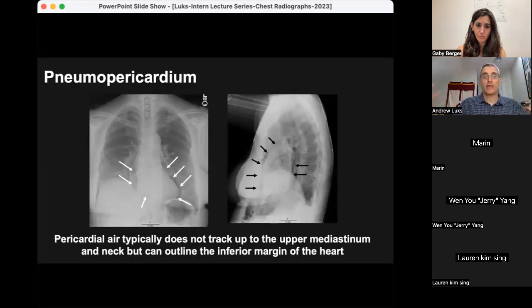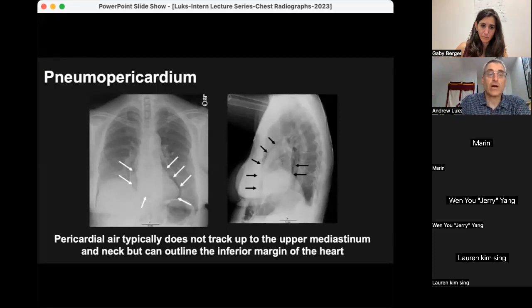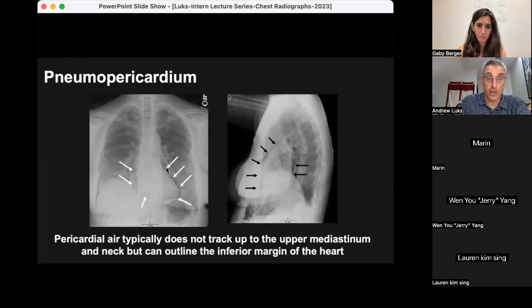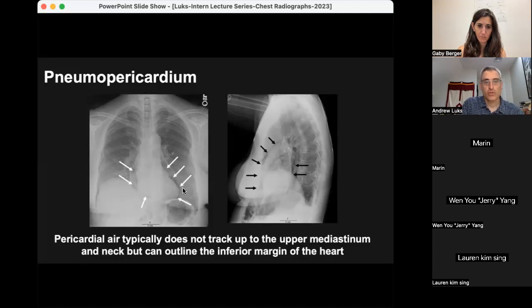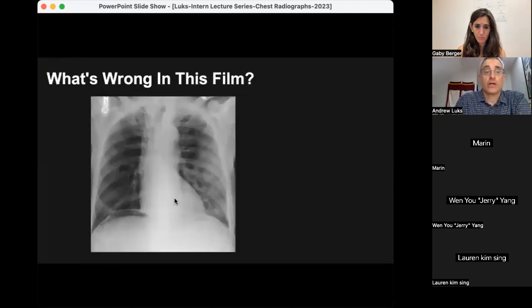Occasionally patients develop pneumopericardium — air that tracks into the mediastinum and dissects into the pericardial space. It often looks like pneumomediastinum, with lucency on the lateral aspects of the heart, but you can distinguish pneumopericardium from pneumomediastinum by the air tracking underneath the heart itself: you'll see a rim of lucency on the inferior margin of the heart.